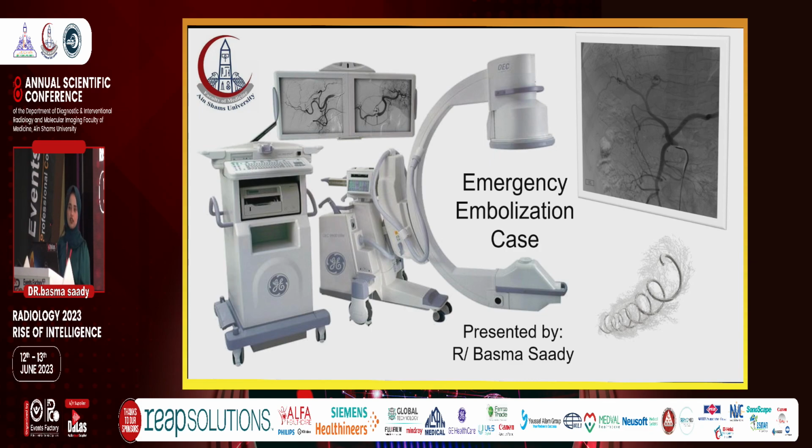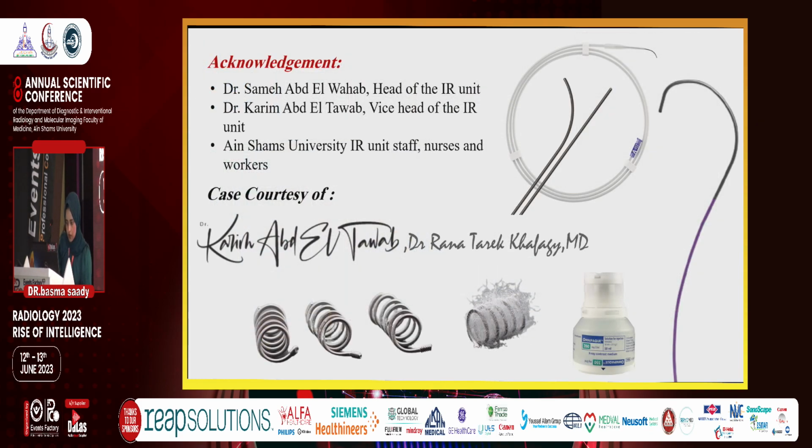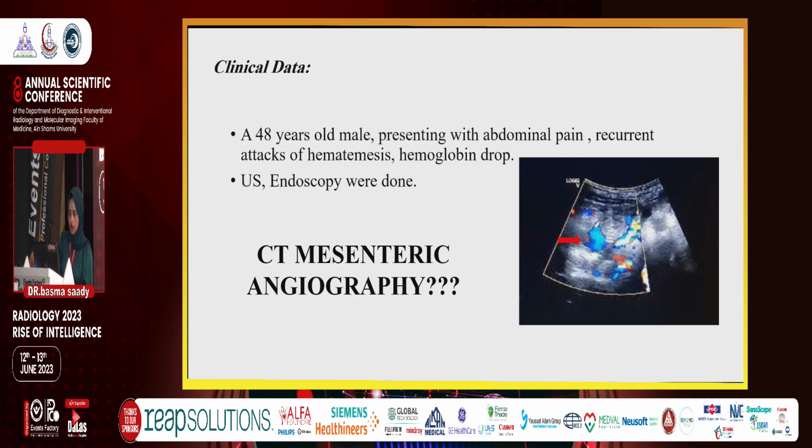I'm so honored to be here among all of the radiology pioneers, and I'll be presenting an emergency embolization case that was done in our interventional radiology unit. Case courtesy Dr. Karim Abtawab and Dr. Rana Khafik. Here we have a 48-year-old male presenting with recurrent attacks of abdominal pain, recurrent hematemesis, and hemoglobin drop.